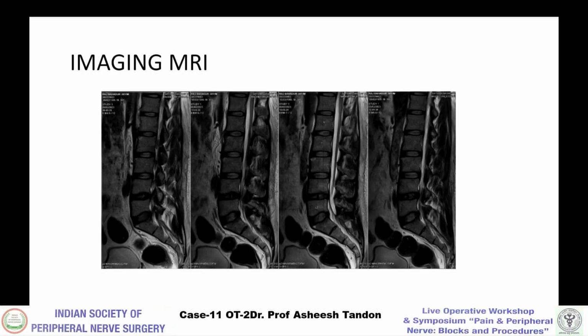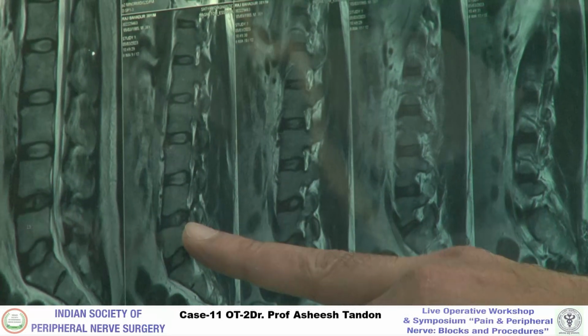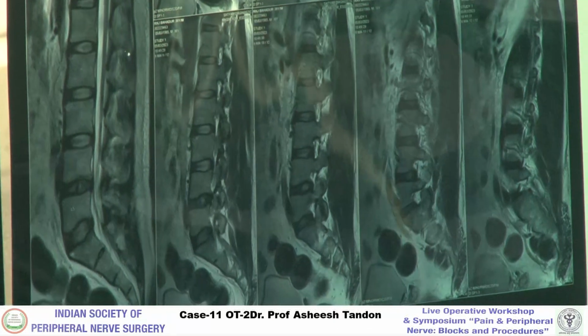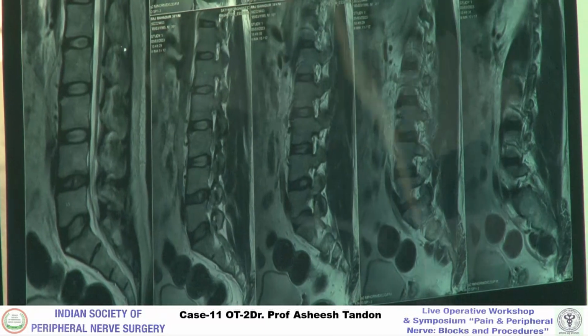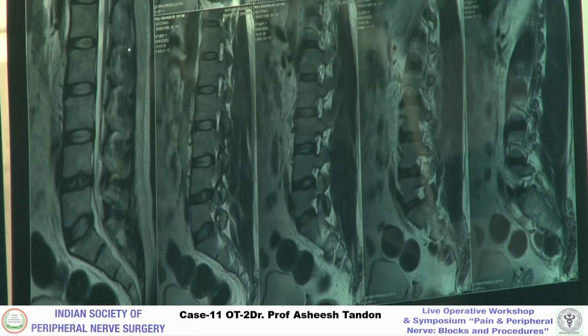Okay, and as far as foraminal stenosis is concerned, just one cut before where you have the foraminal cut, you have significant stenosis that is seen. So Ramesh is going to do the procedure, and the plan is to do not just an interlaminar epidural but also a left far lateral transforaminal.